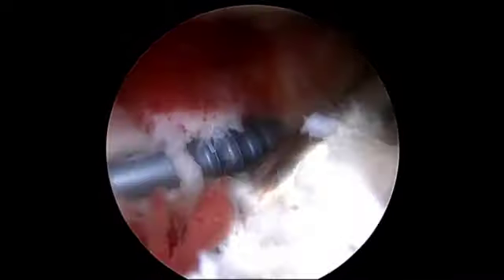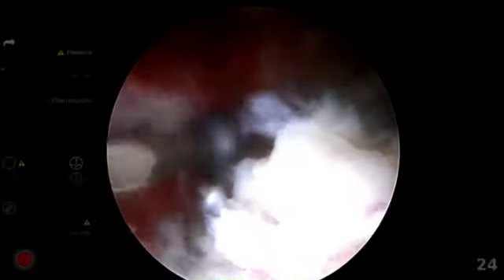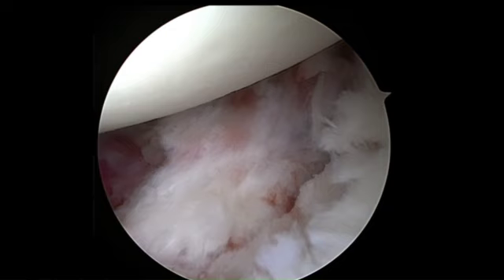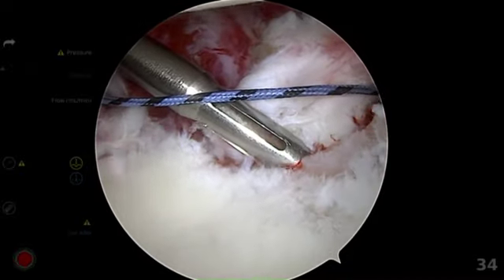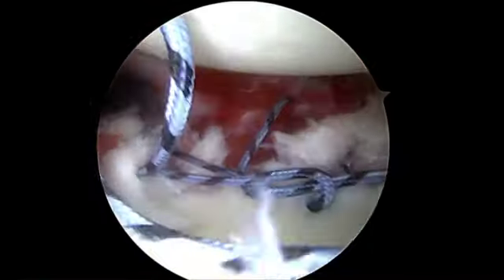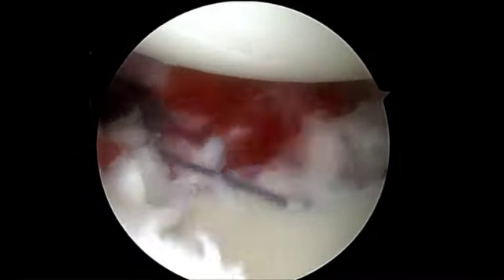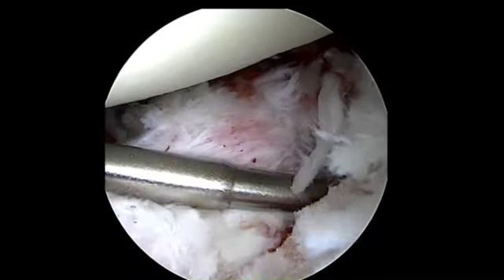The inferior screw was then placed in a similar fashion. Both screws demonstrated good purchase, and the fracture was then formally reduced, as can be seen here. Following bony fixation, the fracture was further stabilized. With imbrication, a capsulolabral repair was initially made superior to the fracture bed. An additional capsulolabral repair was performed inferior to the fracture bed.